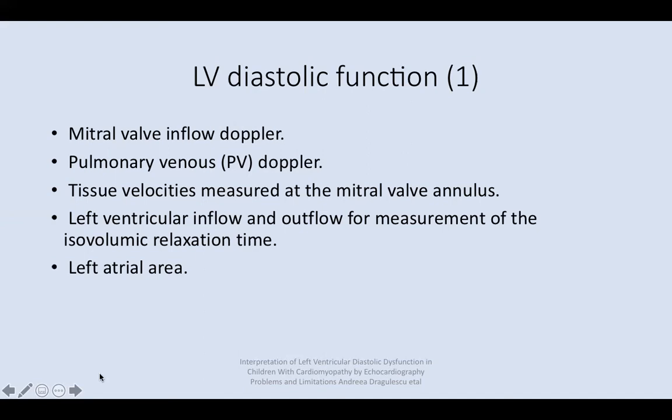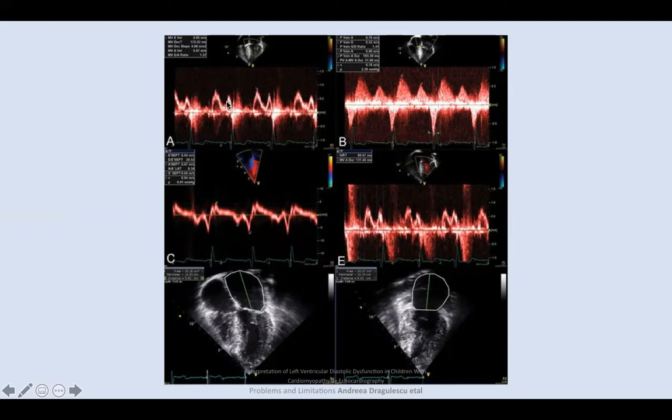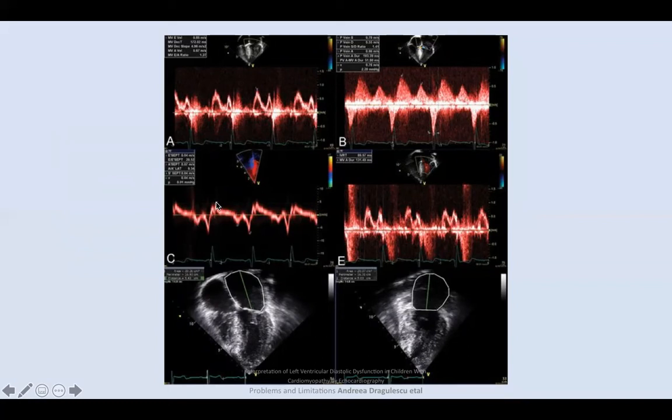Here, this is a mitral valve inflow Doppler — you will get E and A. Here is the pulmonary venous Doppler: S, D, and A. This is a tissue Doppler: E prime, A prime, and S. And here, this is inflow and outflow: E and LV outflow. This is the assessment of LA area in two-chamber view and in four-chamber view.